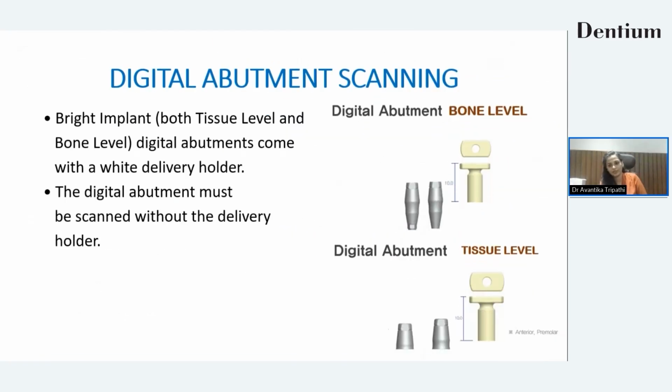As I mentioned, this white portion over the digital abutment is a delivery holder. So this should never be scanned. This is only and only to hold the digital abutment seated properly in the patient's mouth and to tighten the screw through it. It is not for scanning purpose.